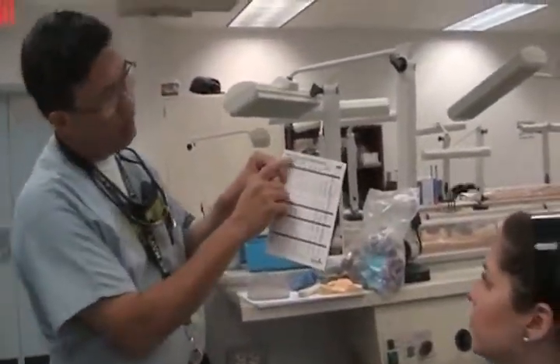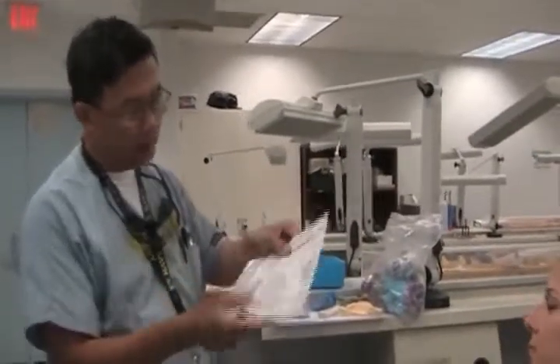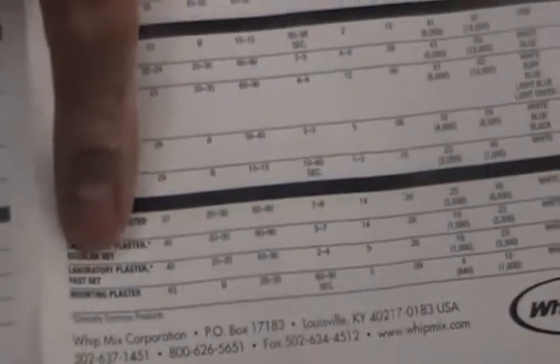Are you reading up on this? One hundred percent. This is really helpful — I'm glad I came today, especially since I have to do this on Monday. If you're unsure about what these stones are, Mix is the company; these are the products they carry — the die stones used for models. There's also mounting plaster and mounting stone. All the information about water-to-powder ratio and mixing time for each one is available in any box.